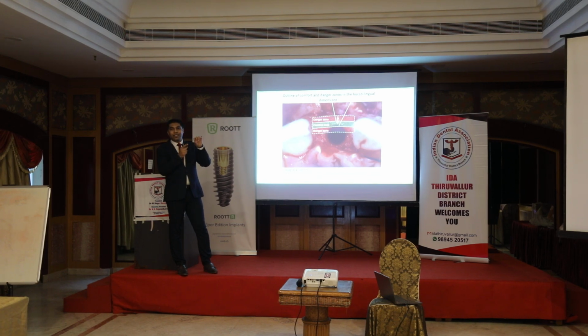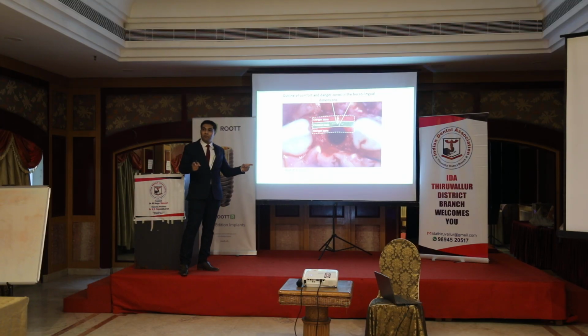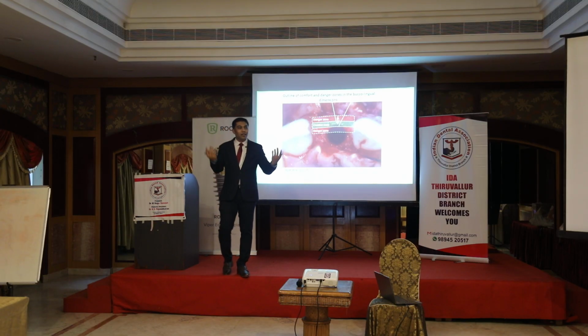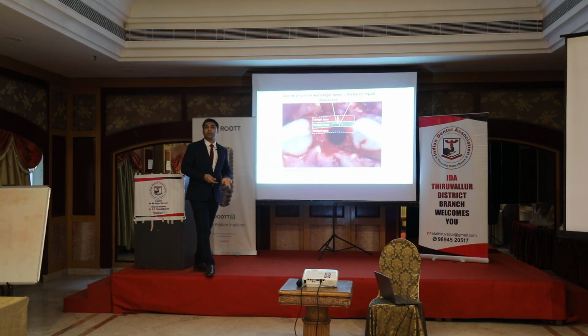implants on this. And then in the third area, the patient will come to you and you will see a completely exposed abutment area. And there is no way you can solve this issue, because you don't have a reason which will justify it. And this treatment will be in terms of time frame the same as placing your implant. Like in Dhru's case, it almost took him 6 months, with all those complications, to pursue and complete that case.